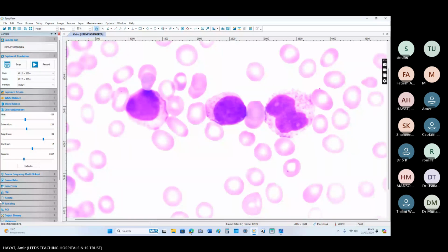Okay, so the blood film contains leukocytosis with many leukocyte precursors. Most of them are granular, some of them are bilobed, which is consistent with acute leukemia, most likely acute promyelocytic leukemia. This is a hematology emergency which would need emergent assessment of the patient, investigations, and initiation of the treatment.